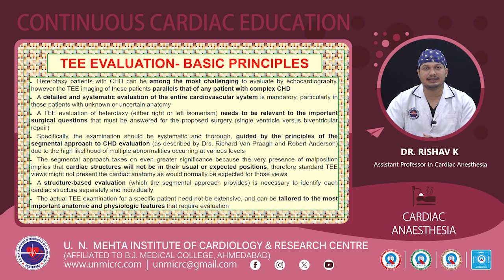The segmental approach to CHD evaluation was described first by Van Praag and Anderson, and the segmental approach is a methodology that emphasizes the importance of visualizing structures. In case of a normal TE examination, what we do is we go by different standardized views, but in this case we have to go not via standardized views, but through evaluation of various structures.